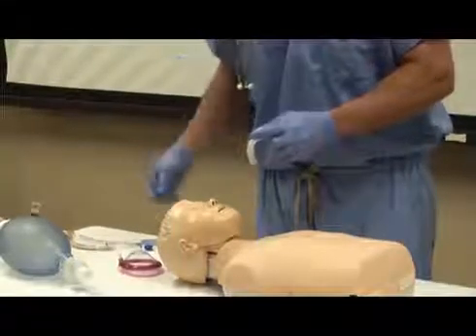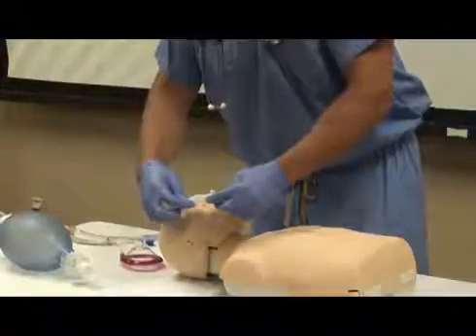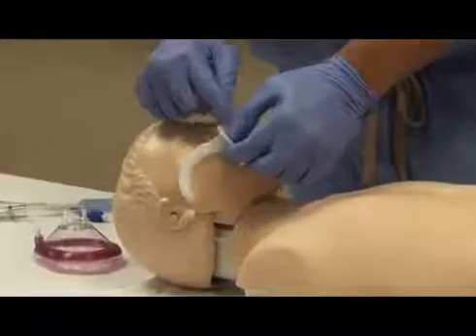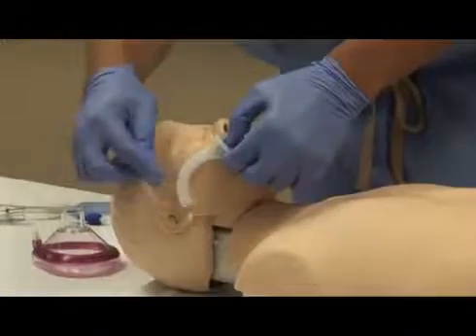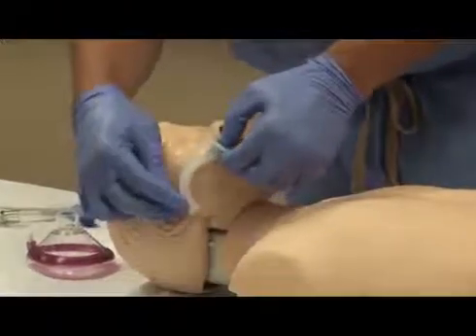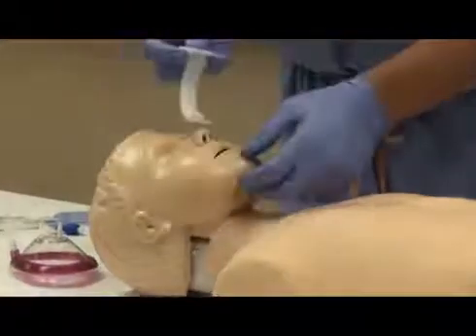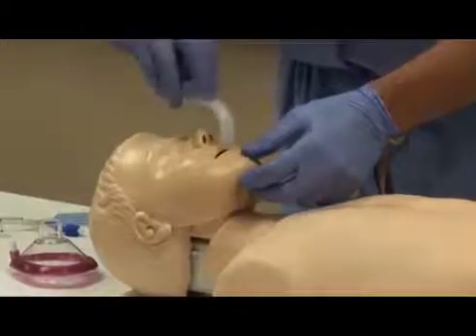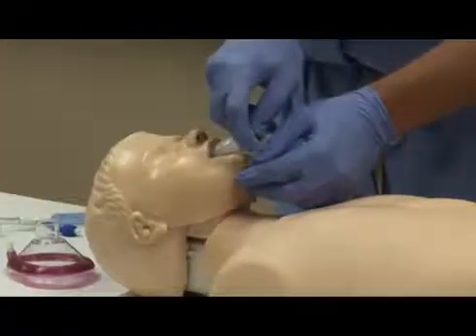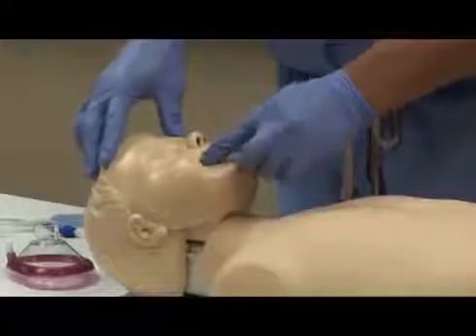Selection of a proper sized oral pharyngeal airway is done by assessing the flange at the lips of the patient, and the tip of the airway should be at the angle of the jaw. Insertion is achieved by pointing the tip toward the hard palate then rotating 180 degrees until the tip reaches the posterior pharyngeal wall.